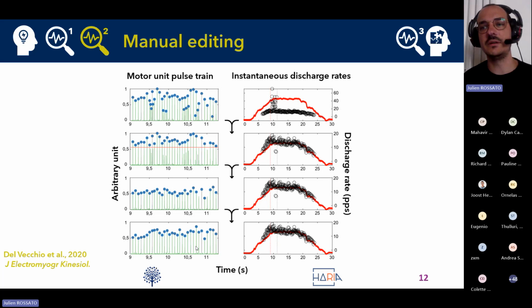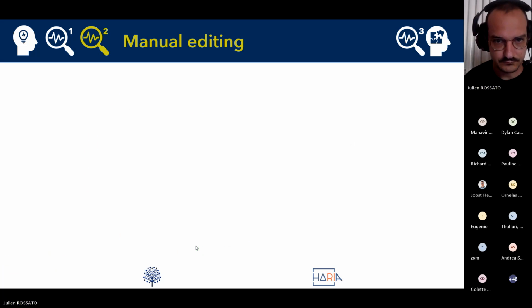level. Each time you modify the discharge pattern, you recalculate the separation vector with the new collection of selected action potentials, and then you reapply the separation vector on the EMG signal. You repeat this process until no outliers are present and all clearly distinguishable spikes have been selected.